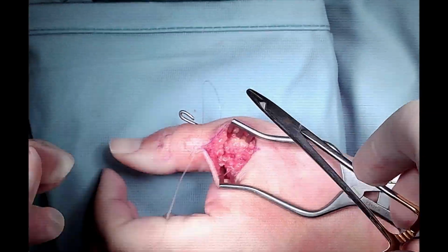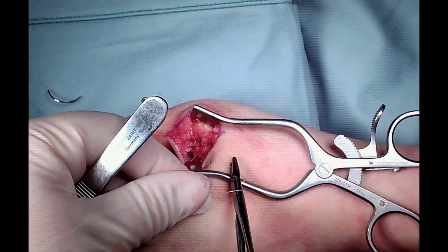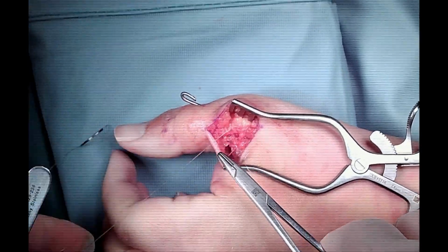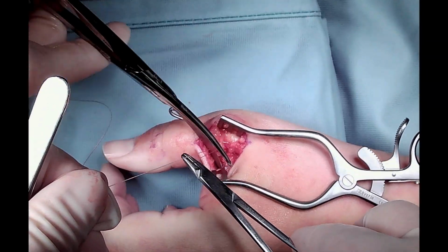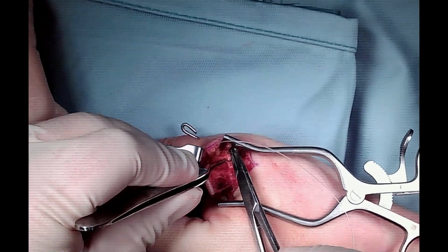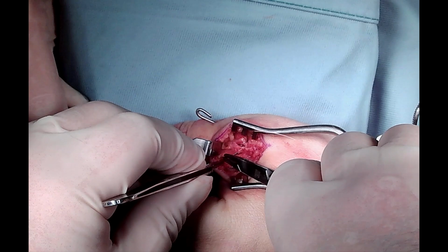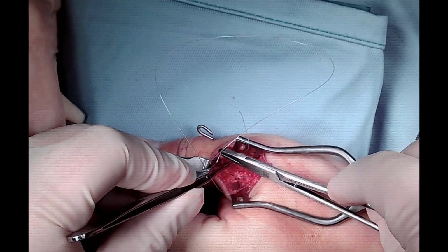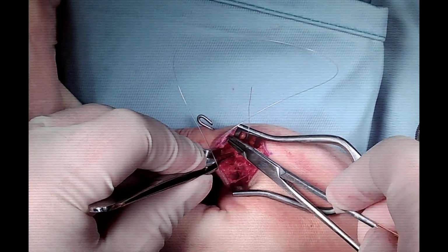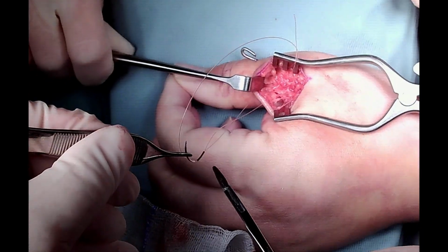Following this, we close the soft tissue in layers, subcutaneous and the skin, in this case with the help of the 4-0 Vicryl Rapid suture. The pin that we put here, we take it out in office in 3 weeks in order to allow range of motion, and it is followed by occupational therapy.